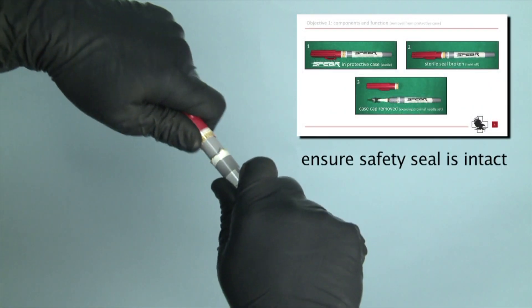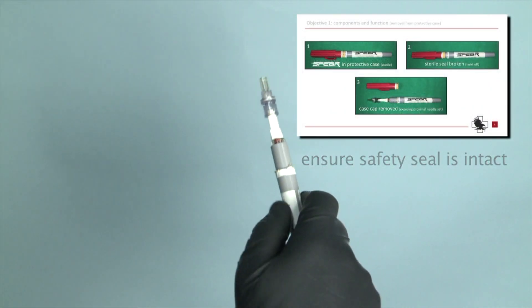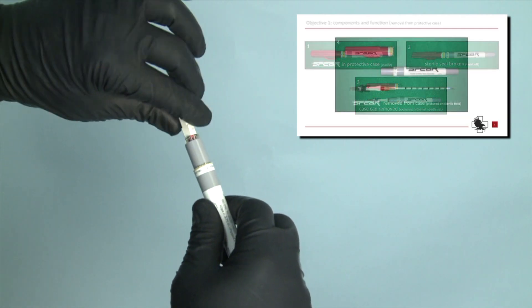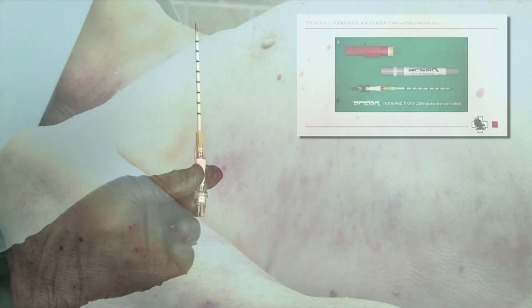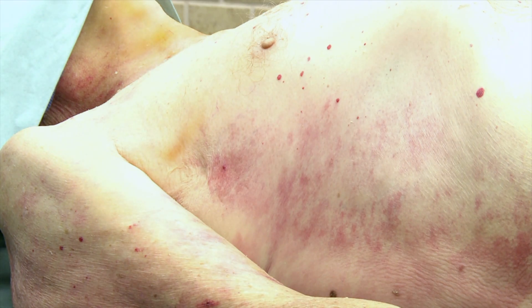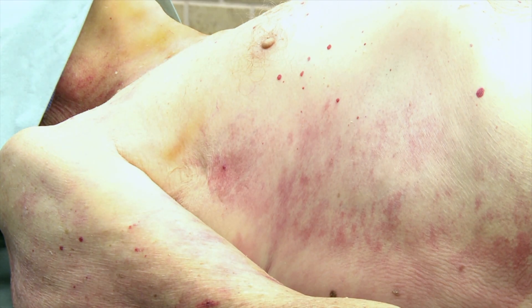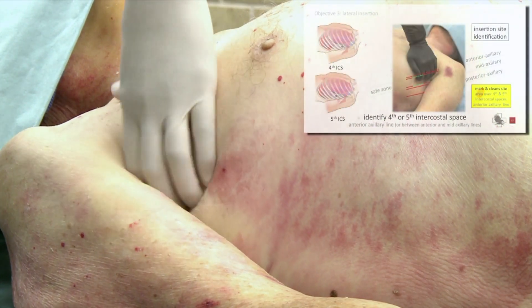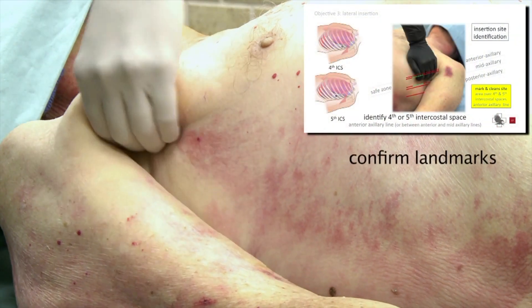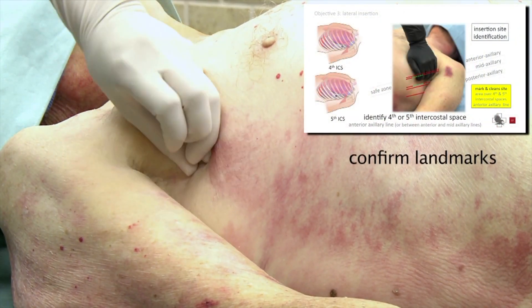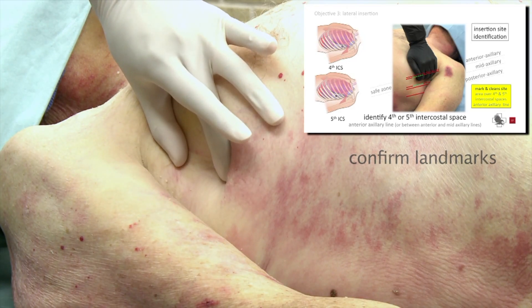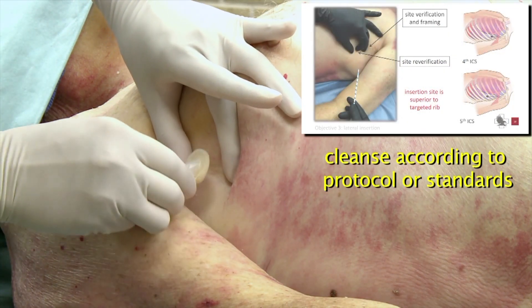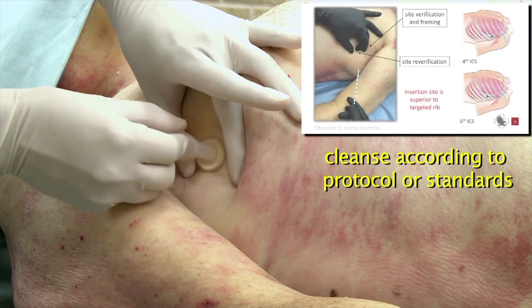Grasp case and ensure safety seal. Twist off cap and remove spear. Confirm landmarks: 4th or 5th intercostal space, anterior axillary line. Cleanse according to protocol or standards.